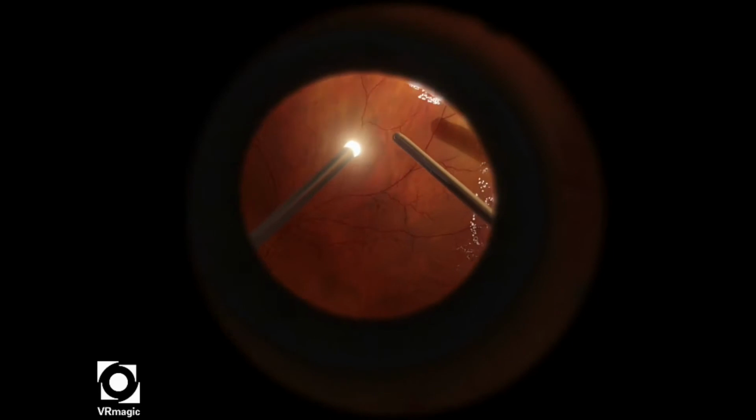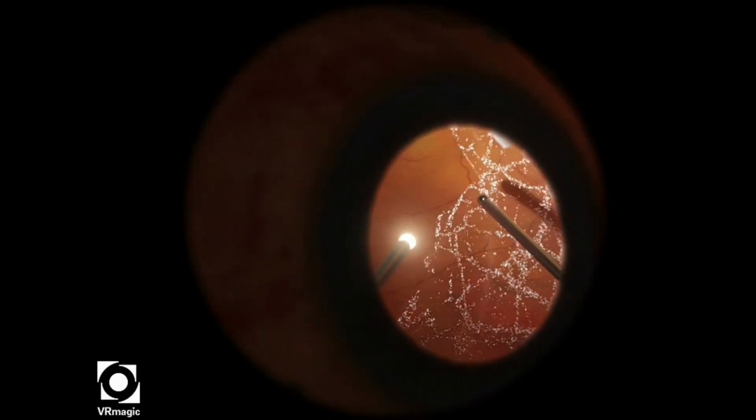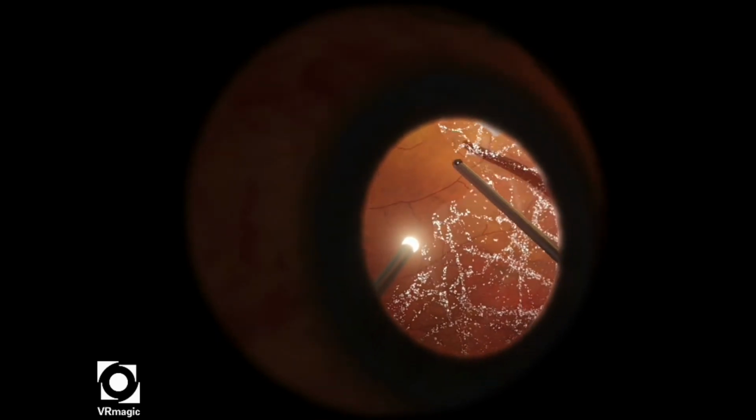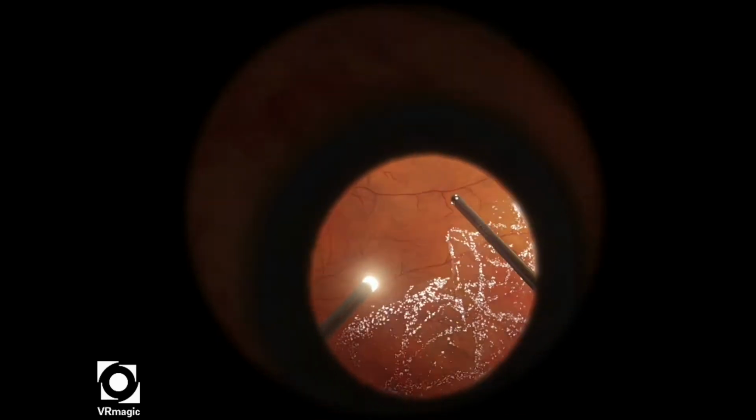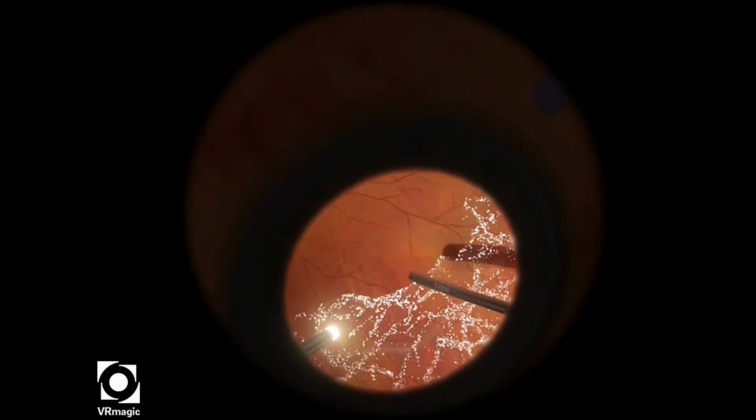I'm using a relatively lower magnification at this particular point because I want to be able to see as much of that peripheral retina as possible. But I will zoom in a little bit more as the case progresses.